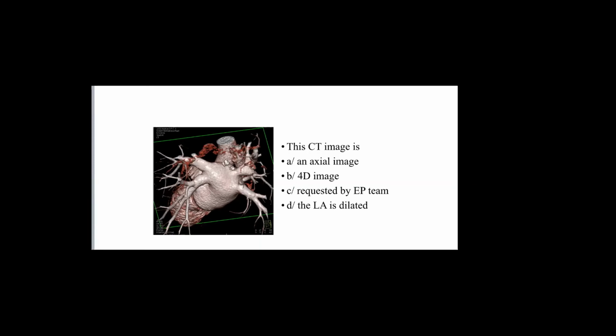The right answer is C, requested by the EP team because it is mainly directed to mapping this volume rendering. That is so right.